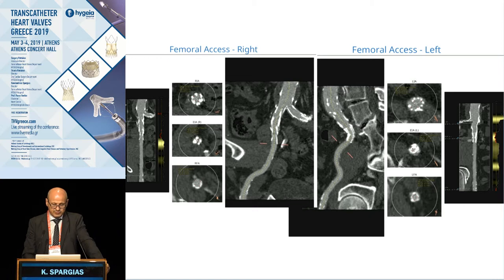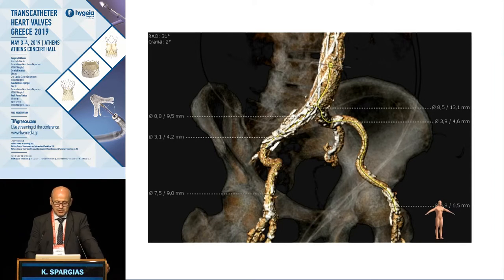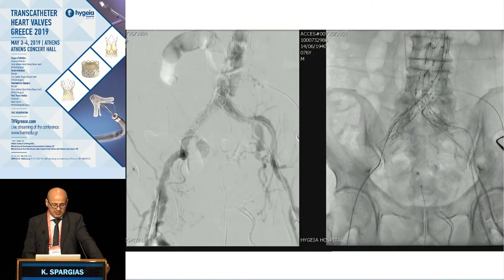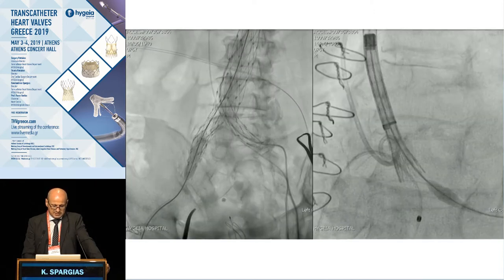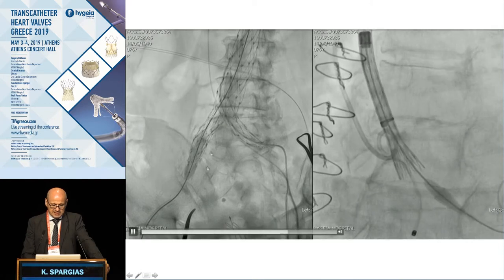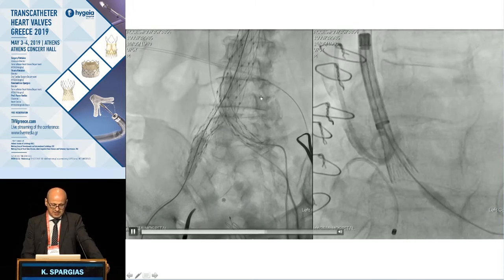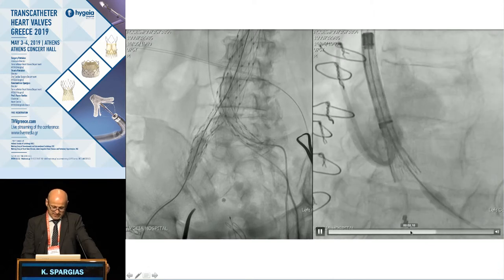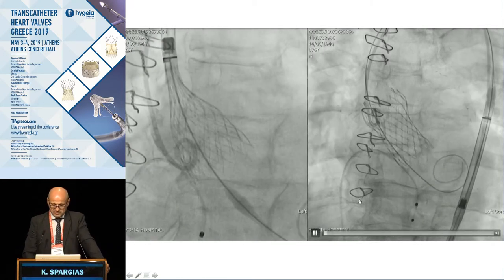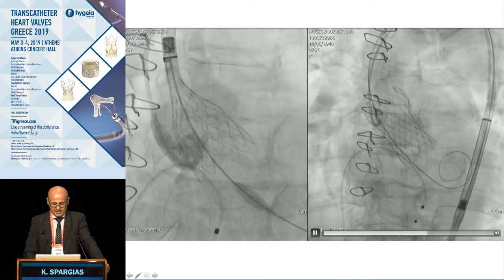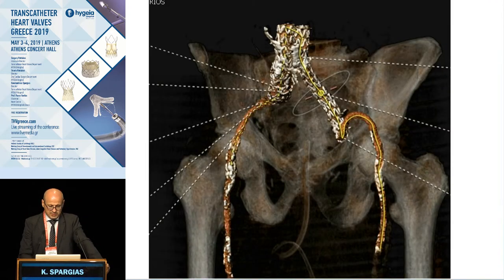Another case had grafts in the abdominal aorta extending down to the iliac arteries. Grafts are not a contraindication if everything else is acceptable — especially if the diameter is large and tortuosity is not extreme. We proceeded, performed dilation at one point to achieve the desired diameter, advanced the 14 French eSheath, and successfully implanted an Evolut R 29 mm valve. The final peripheral angiography showed a very good result without any complication.